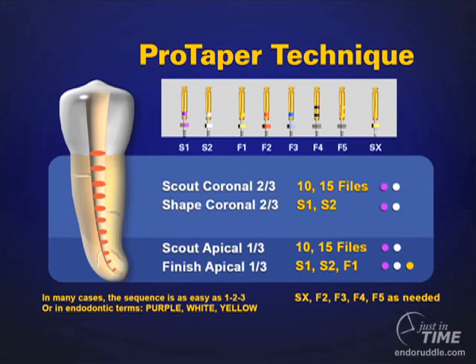This means when we get working length, it'll be more accurate and less likely to subsequently change. So the 3 things we like to do when we scout the apical 1/3 is we get a known working length, we need to confirm the canal is patent and not blocked or obstructed, and finally the decision should be made right here with the 10 and the 15, do I have a reproducible glide path? If the answer is yes, then this region can be mechanically shaped starting with S1 and irrigating, recapitulating, and re-irrigating after every rotary file and going through the series minimally to an F1.